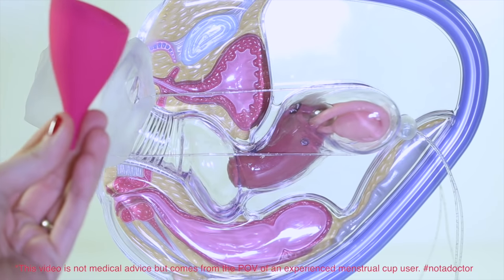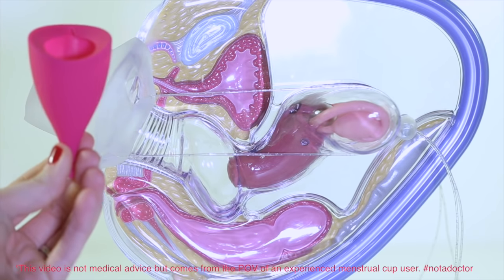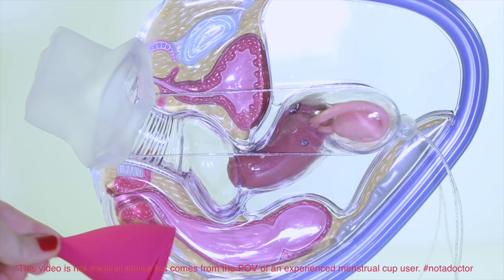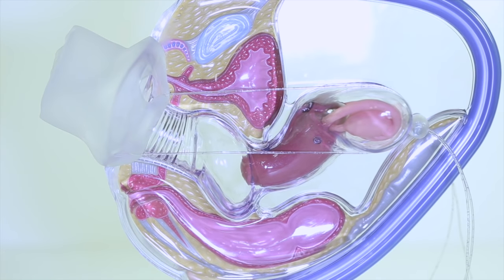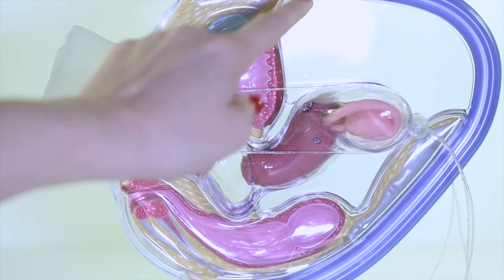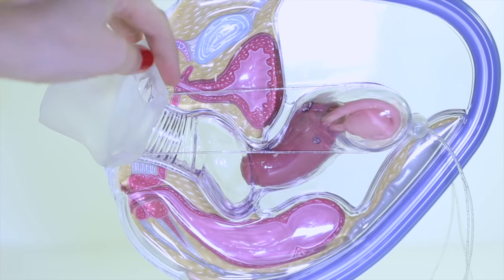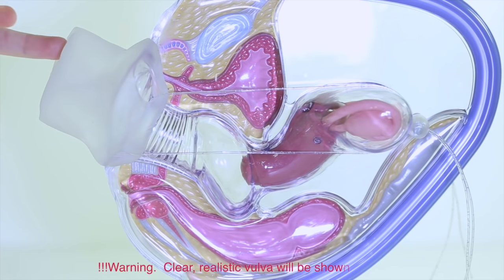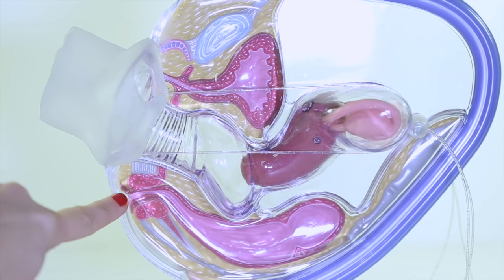This is a representation of what's inside your body, and this is a cup that's going to go inside of your vagina. Let's meet some of the parts and discuss how they all interplay. This is your uterus, and you have ovaries on either side. Of course the cervix is at the bottom. We have the bladder above leading to your urethra, which is right above your vaginal opening. The rectum is below.